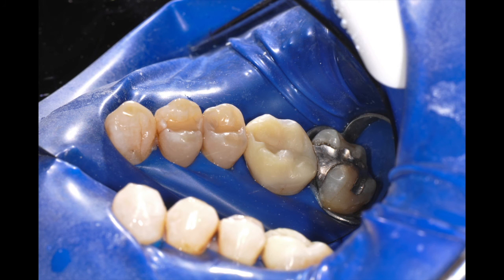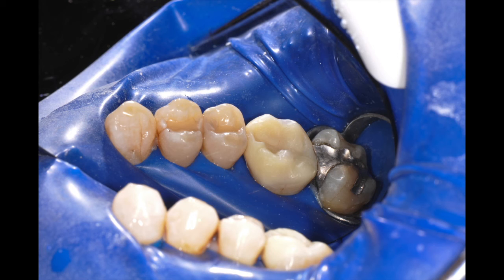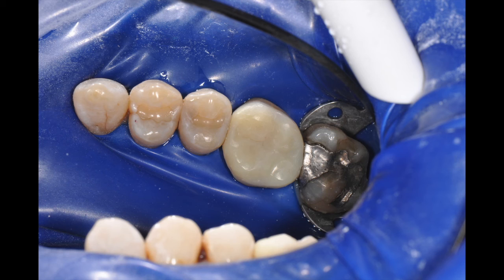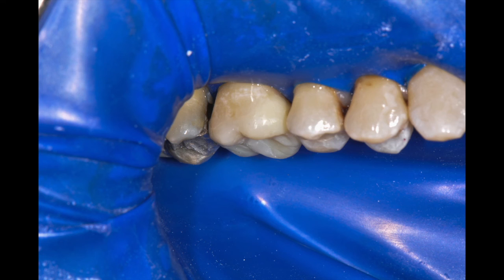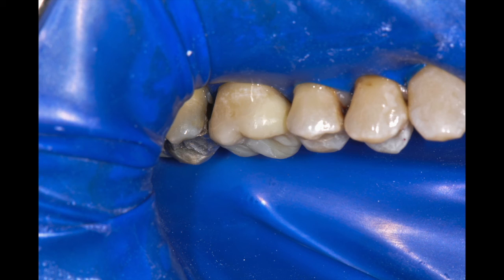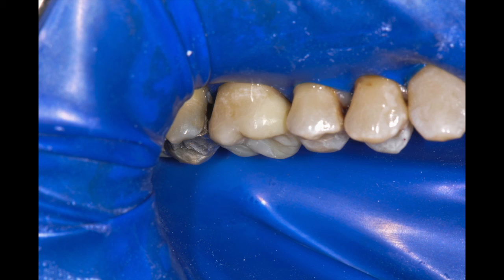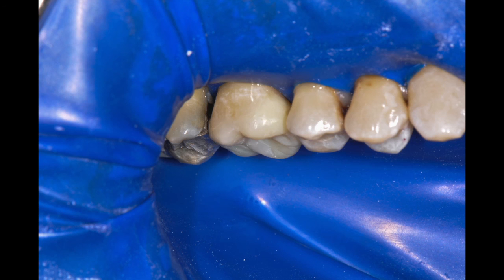Now that the onlay is heat processed and ready to cement, the rubber dam is placed and the onlay tried in. Contacts are usually perfect and the margins should be nearly closed. The preparation is refreshed with 27 micron air abrasion and thoroughly rinsed. Teflon tape is used to protect the adjacent teeth. The tooth is primed and bonded, with the bonding agent mixed with a dual cure activator to assure complete polymerization during the cementation process. This restoration was cemented with a heated composite to increase flowability and eliminate the possibility of a void or gap at the margins.